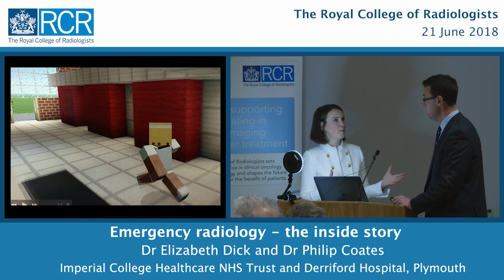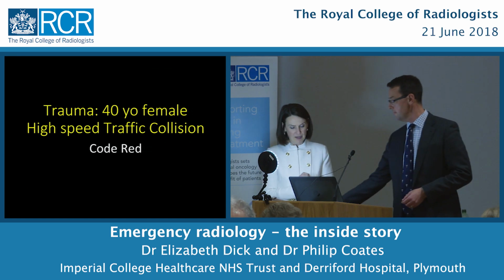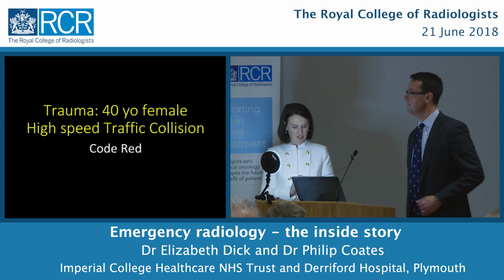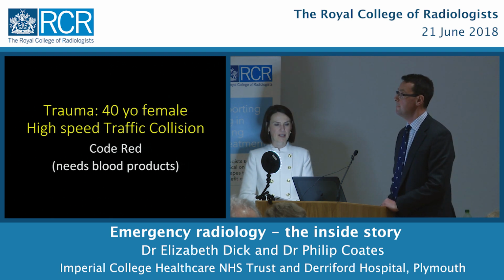That's right, so we've got another trauma patient, Phil, and this patient is code red. And what code red means is that the patient is going to need blood products, so they're unstable, so we've got to take this very seriously.